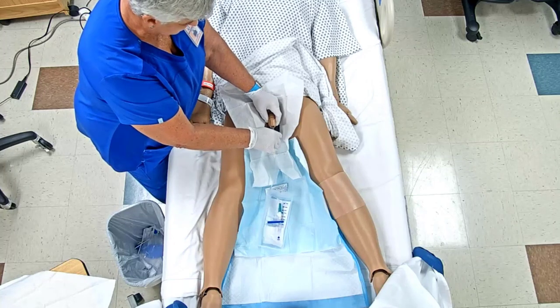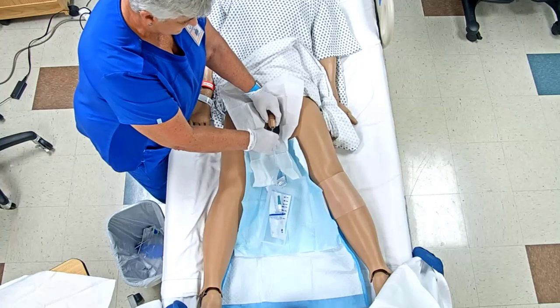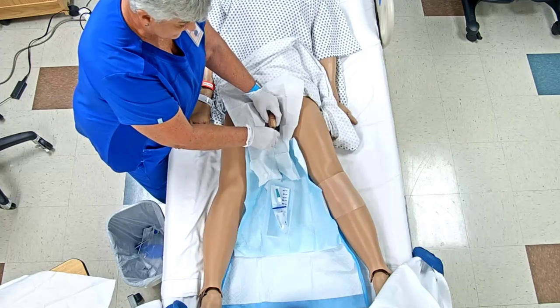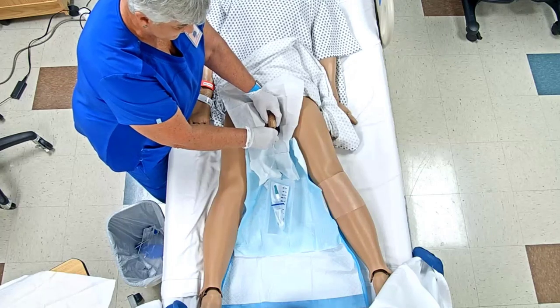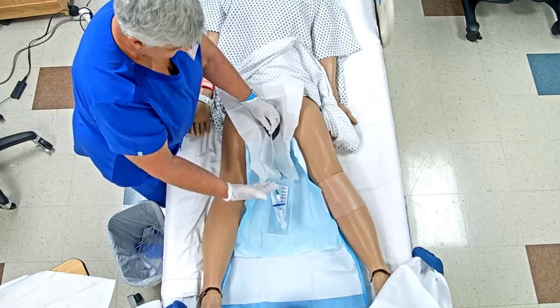Now on a female, remember, and I've got a lot of lubricant on here, so you don't want to let loose of my hand here as I put it in. On a female, 2 to 3 inches, but on a male, you're going to have to go 7, 8, 9 inches. Once I do see urine, okay, just a little bit further, then I need to hold it in place, because otherwise it's going to slide out, okay?